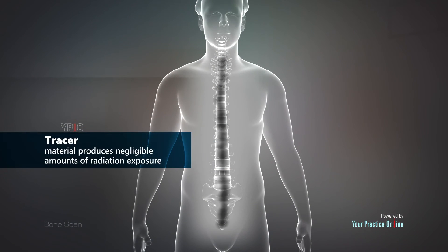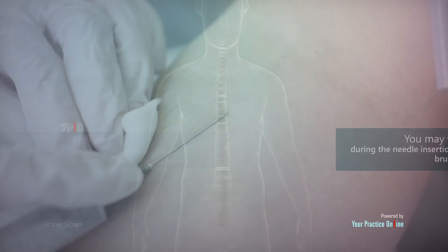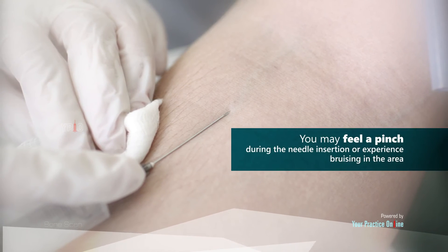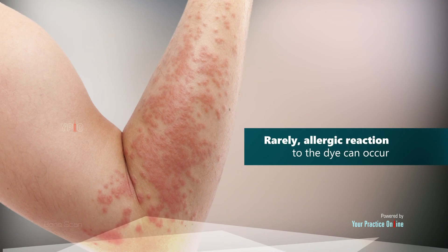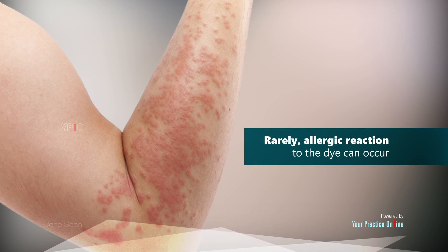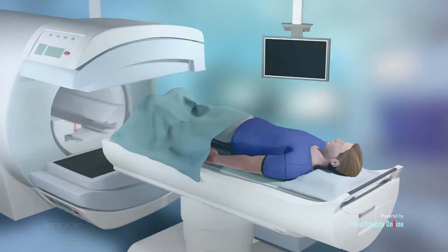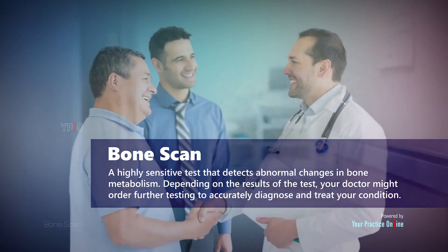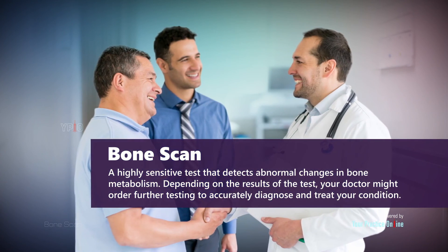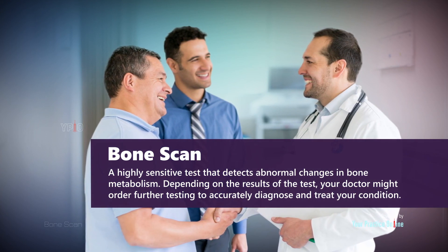There are minimal side effects from a bone scan as the tracer material produces negligible amounts of radiation exposure. You may feel a pinch during the needle insertion or experience bruising in the area. Rarely, an allergic reaction to the dye can occur. A bone scan is a highly sensitive test that detects abnormal changes in bone metabolism, and depending on the results, your doctor might order further testing to accurately diagnose and treat your condition.